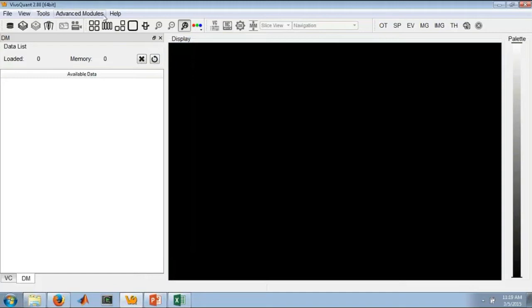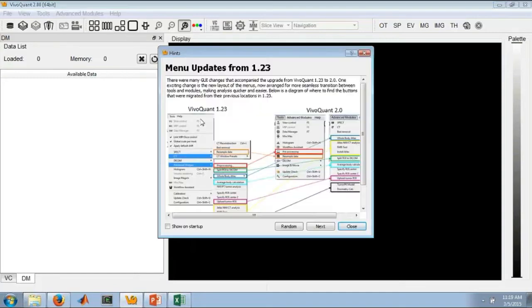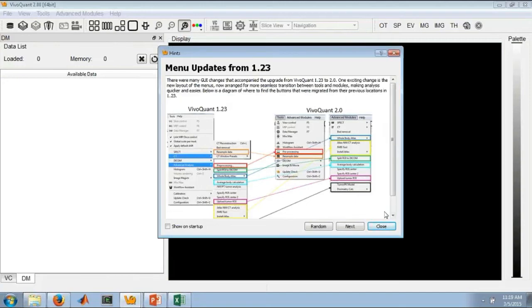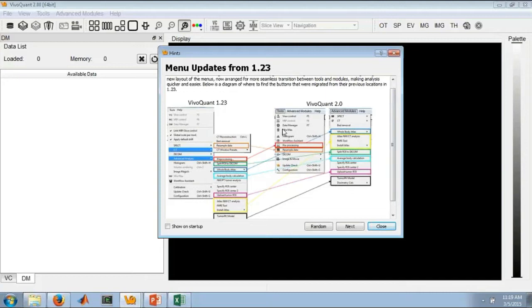One thing I will point out in the hints, we have a brand new hint. If you're not familiar with the hints, I definitely recommend you check them out. In here we have a quick dialogue that shows where the old buttons were located in the Tools menu and where they're located now in the new VivoQuant 2.0 layout. We like to think that the new layout is more intuitive and more workflow-based so that you can more quickly navigate.